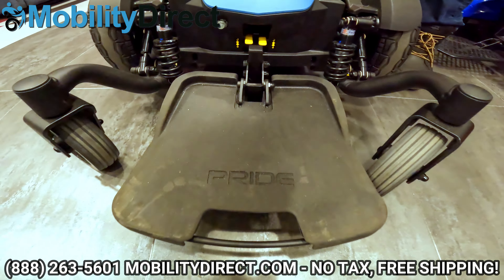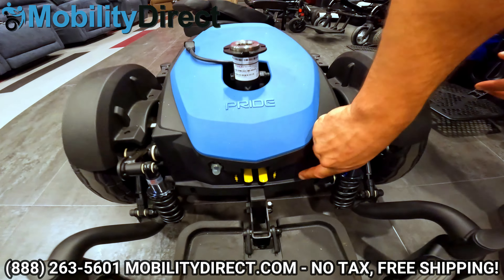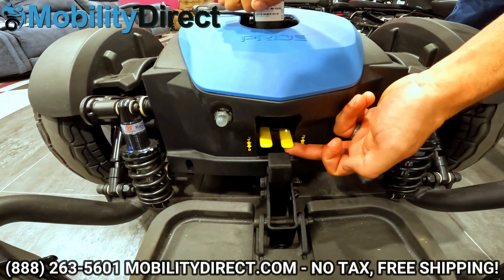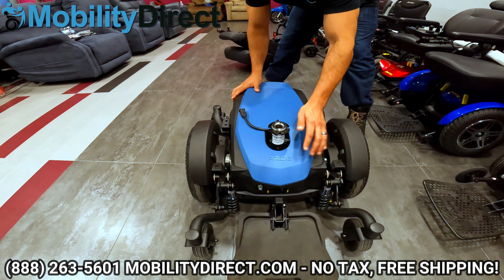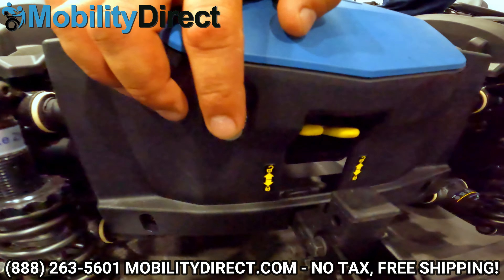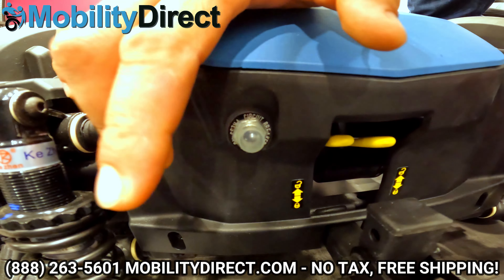As you can see, it's got a really nice shroud cover — a big main shroud cover. Remove the screws and you can pop this off to access everything inside. On the front of the unit, here are the brake levers. Just like all powered mobility products, you've got automatic electromagnetic brakes, so you can't manually push this chair. To move it without the joystick installed, disengage the brakes by putting those levers in the upright position — now you can manually push the chair. Note that you cannot control the unit with the joystick if those brakes are in the off position. Right next to the brake levers, there's a breaker reset button. If you overheat the unit and it shuts off, check if that button is depressed and push it back in to restart the unit.